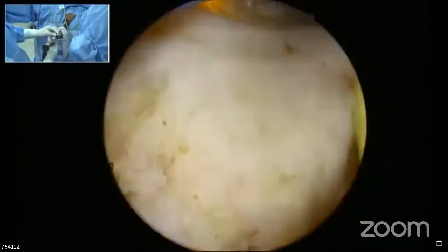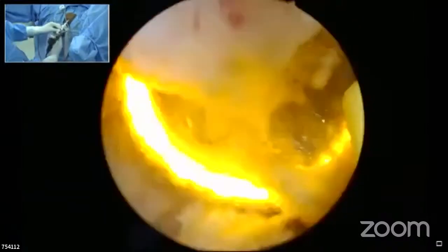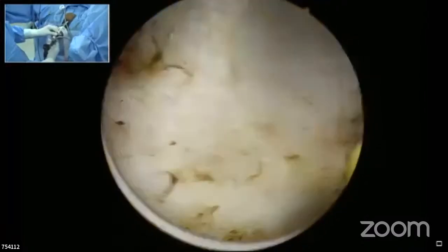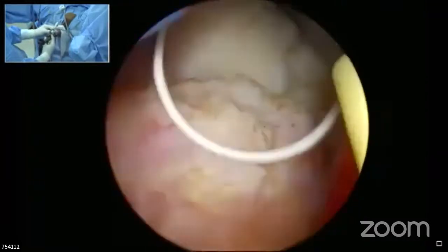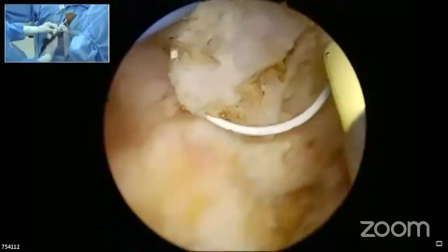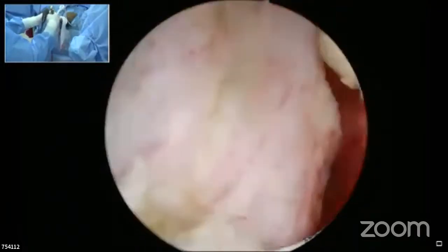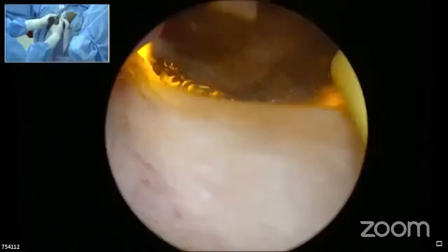This transurethral resection of the prostate is a very technically skilled procedure, and has to be done properly if you want to have a good result. Unfortunately, what has happened is that one paper was published in 1989 in the Journal of Urology, where they had done 4,000 cases in about 40 centers. And the complication list which is shown there has been shown everywhere in all kinds of lasers and promotion of other techniques for the prostate management.